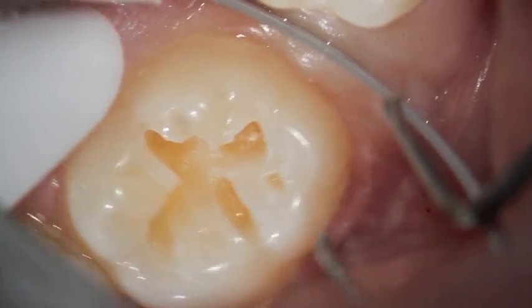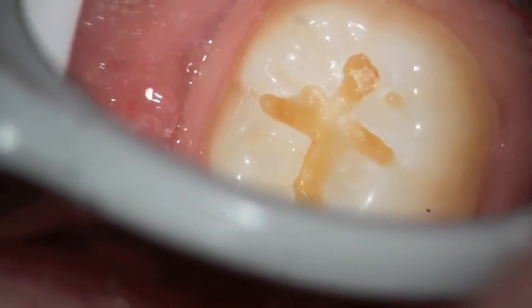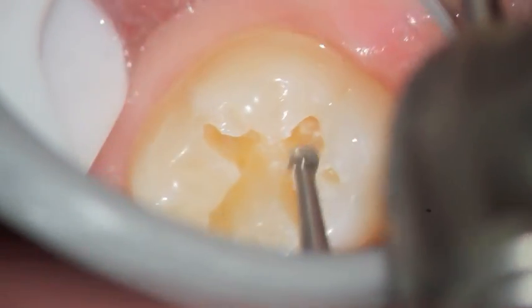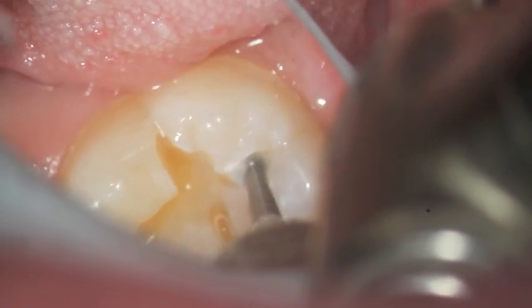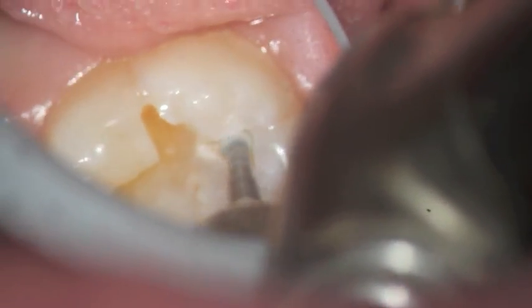So we go back and use another drill bit to clean up the decay. We're using a round burr at a very slow speed. This is about 2,000 RPM, using an electric handpiece that allows us to go in, and we could either use water or sometimes we'll do it dry.